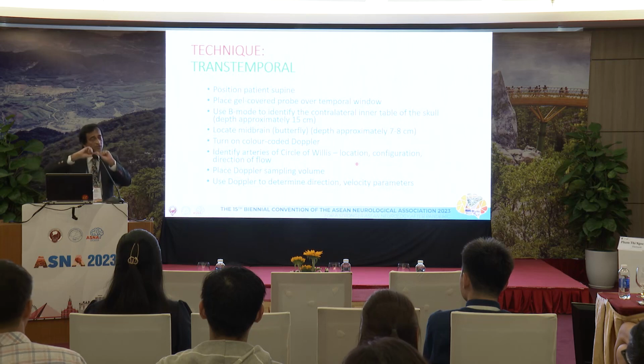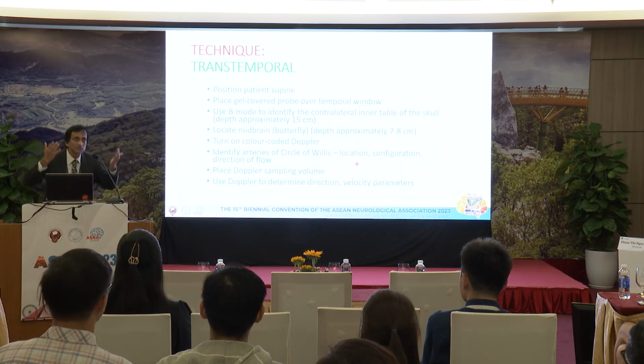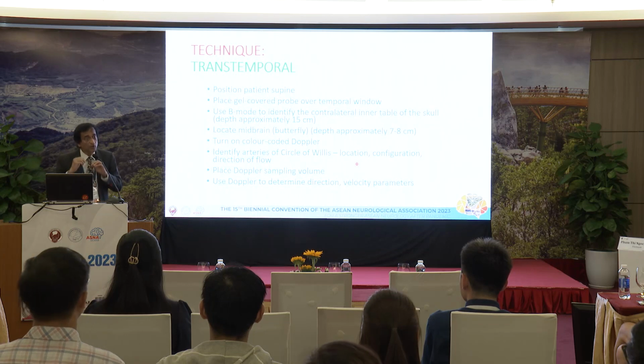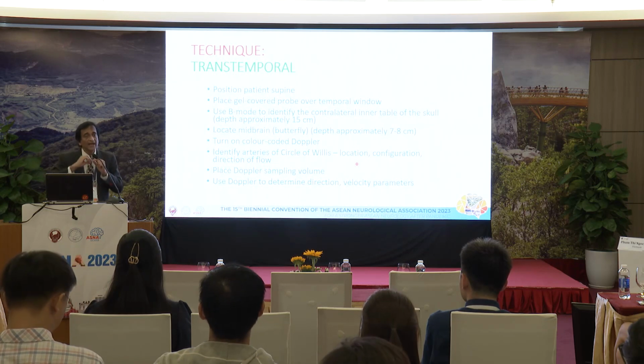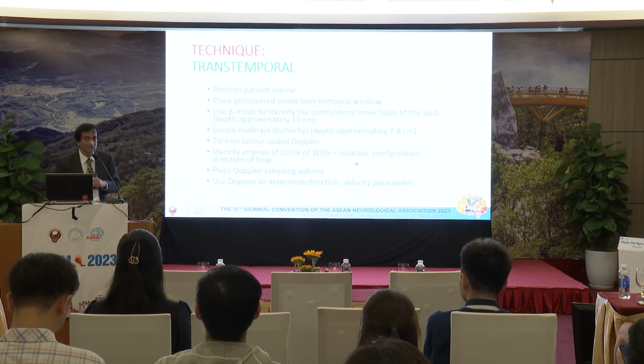What vessel goes around the midbrain? What big artery goes around the midbrain? You heard just now: the posterior cerebral artery. And just in front is the middle cerebral. So by knowing this location, how it looks, and how the blood flows, you will know which artery you're in. I'll show you a picture in a minute.